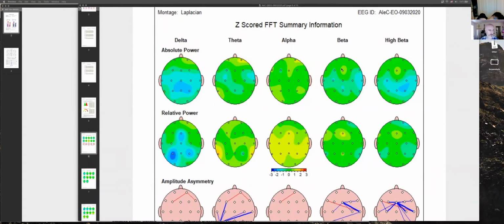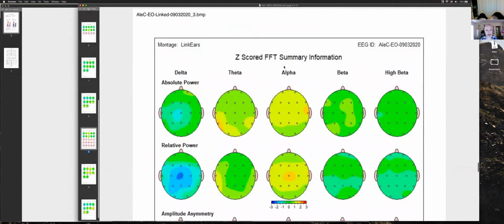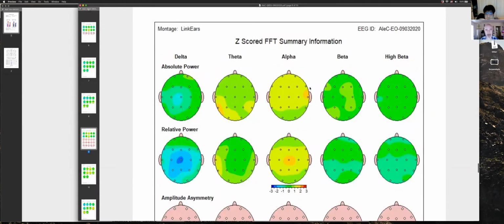It's all right. Where it really shows up for you is if I go to linked ears. You see I pulled back to linked ears, the broad patterns. Now we see some alpha, and eyes-open alpha can mean fatigue, tiredness, or inattention, spaciness. Lack of focus, which we know is kind of true for you. So this can mean some ADD.